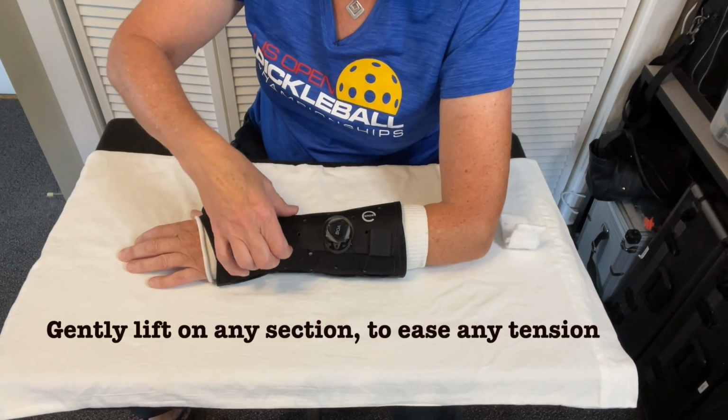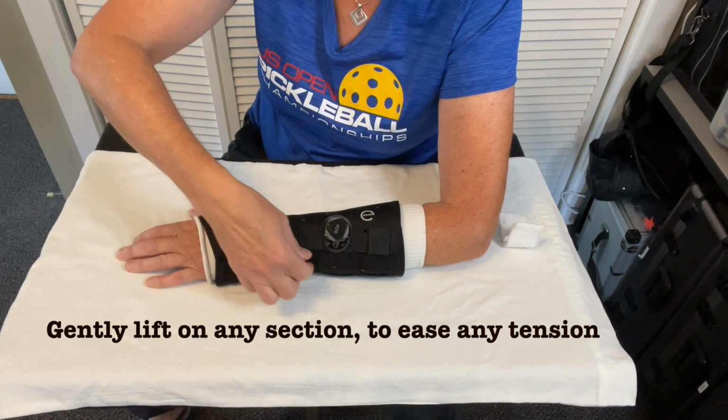It's smaller at the wrist and a little smaller in the palm than is sometimes comfortable. So just to have the ability to spread that some is a really good ability. And again, the sock helps pad it.